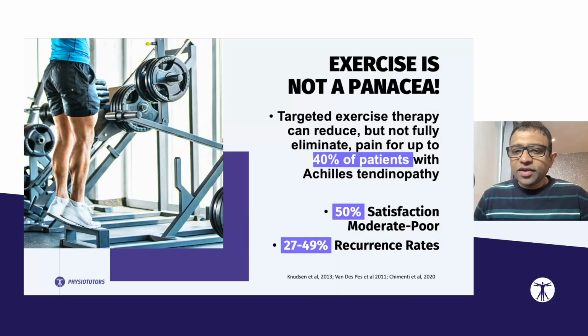There is a significant proportion of patients who will not respond because of health reasons, training factors, or maybe because it just doesn't work for them. Like with any modality, there is a proportion of patients who will not respond, and that's the same as with drugs, and it's also true for Shockwave.